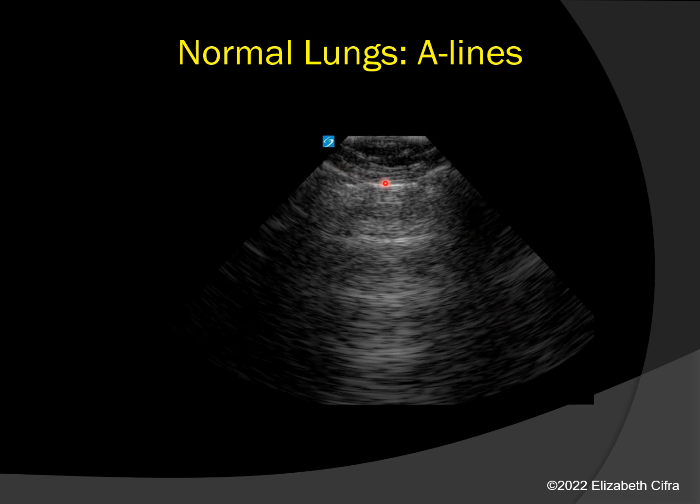In between the ribs, we have the very bright pleura. And the pleura will be seen in a moment moving back and forth as the visceral and the parietal surfaces move over each other as the patient breathes in that very small space. And it's actually a beautiful movement described in various different ways as ants marching in a row or glistening.